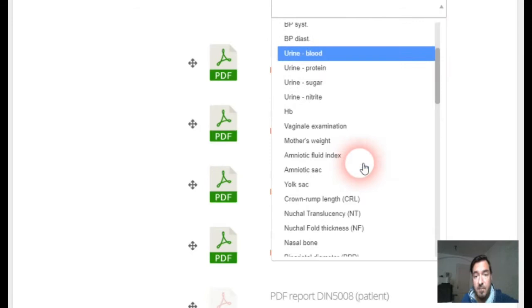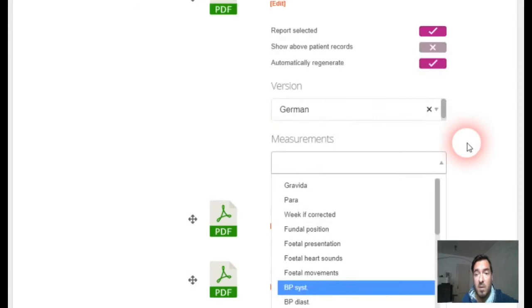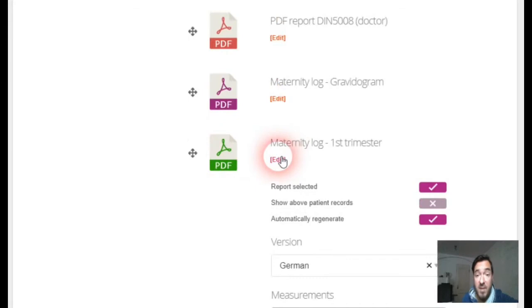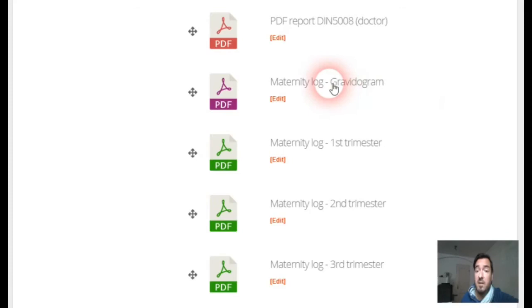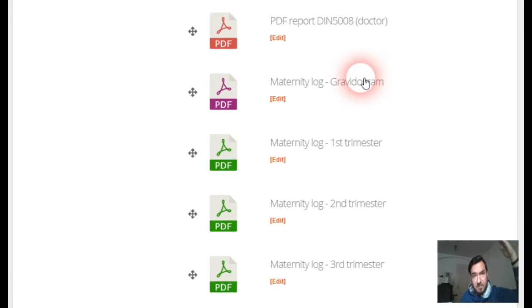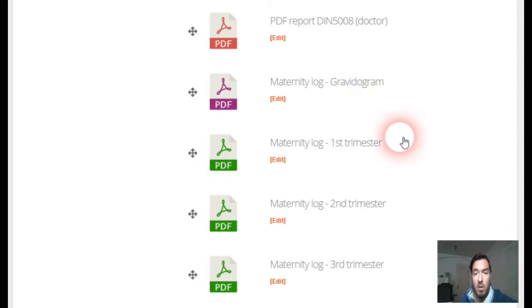Measurements with graphs and so on — this way you can generate a maternity log for every trimester of the pregnancy. At the end there is the gravidogram, which is the pregnancy chart, giving more of an overview of the whole pregnancy.